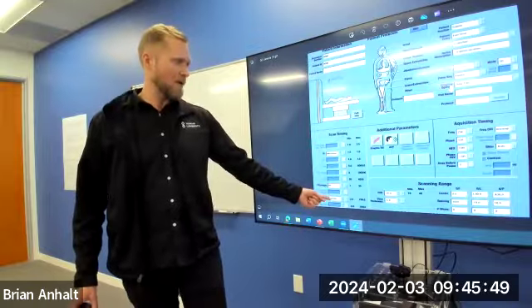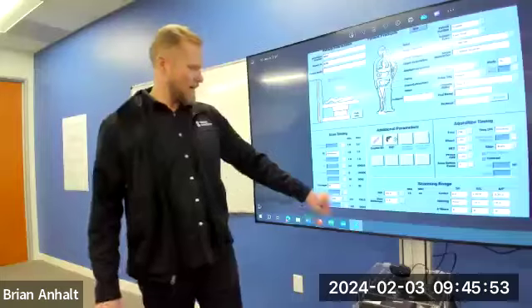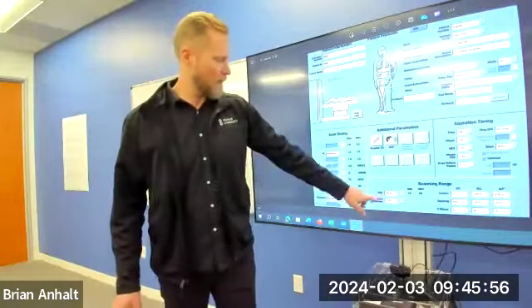Got your flip angle, something called bandwidth that we're going to talk about today. But you can see we can enter that in, right? Field of view, FOV, that's what it stands for.